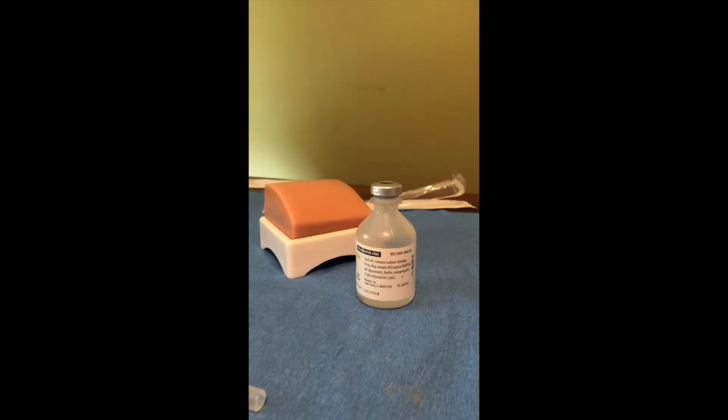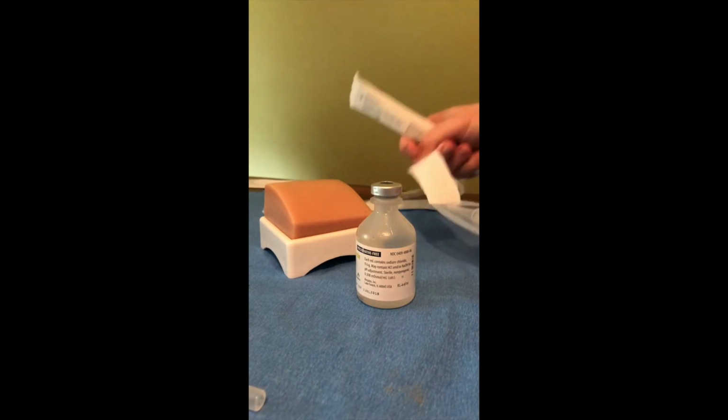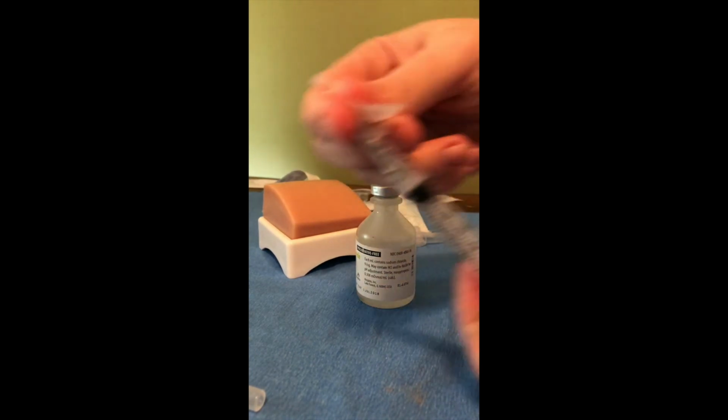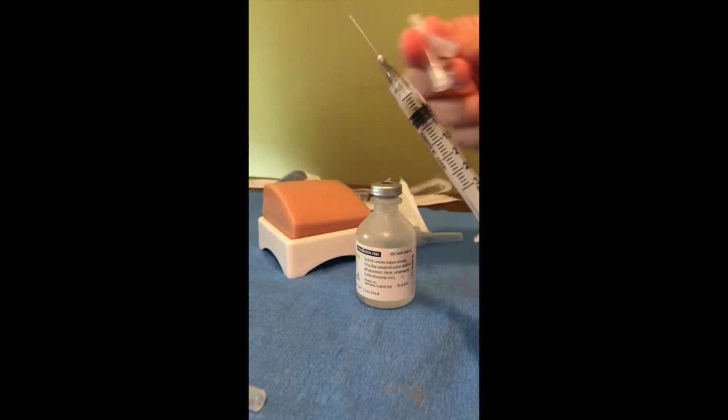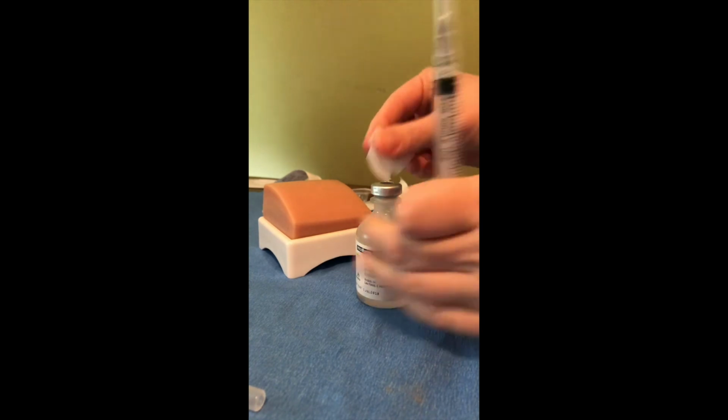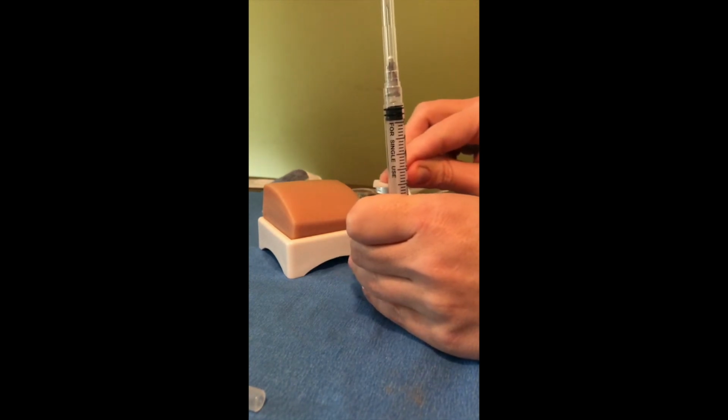Okay, so now we are going to switch to the subcutaneous injection. Like always, I make sure my needle's on tight, pull back on my plunger. Clean the top of my bottle off.